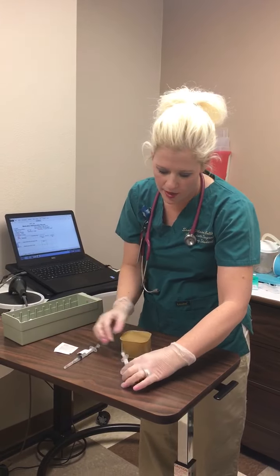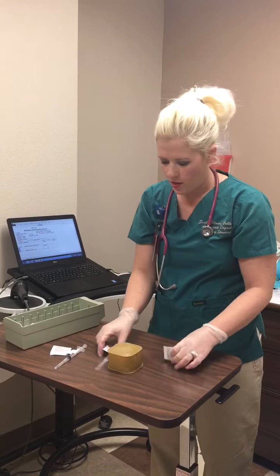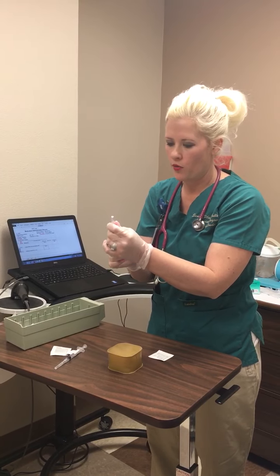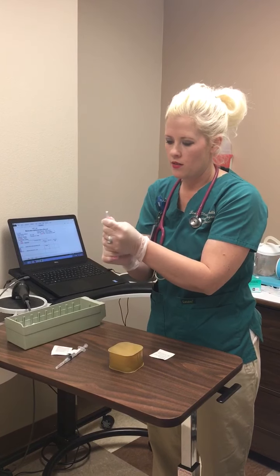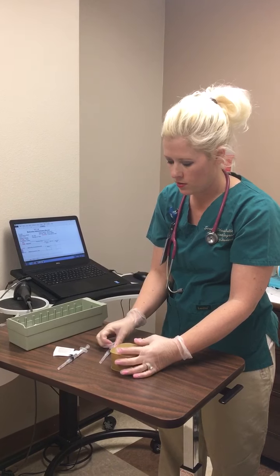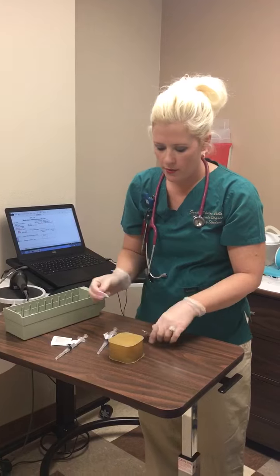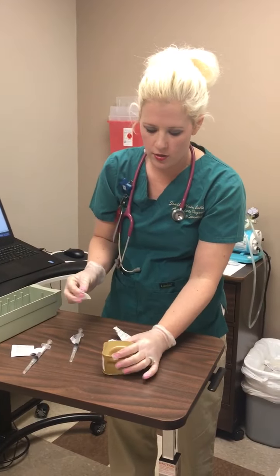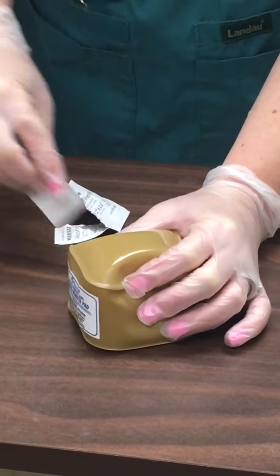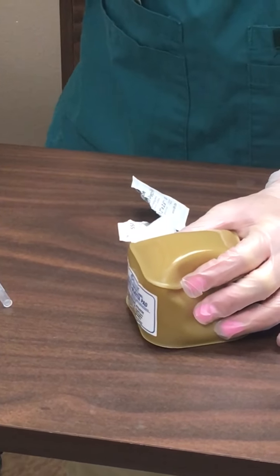I'm going to administer my sub-Q injection first, which is going to be the heparin. I'm going to loosen the cap of my needle so that I don't have to worry about crossing over. Either way is fine. You can take it off here, or you can reach on the other side and do it. Okay, I'm going to open my alcohol swab. I'm going to grab a good piece of tissue, clean from the inside out, and allow the alcohol to completely dry. I'm going to take my needle.